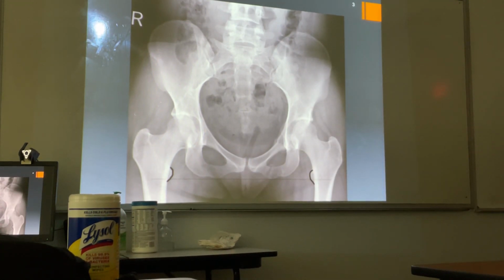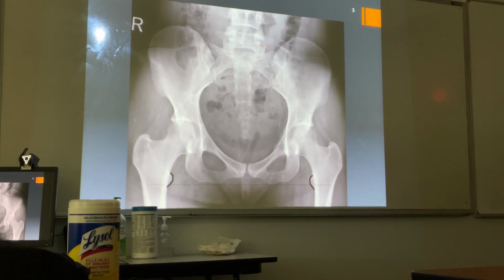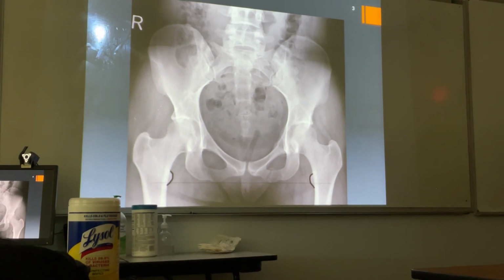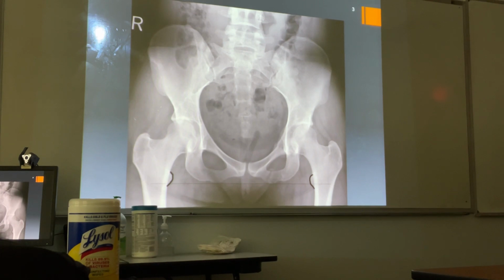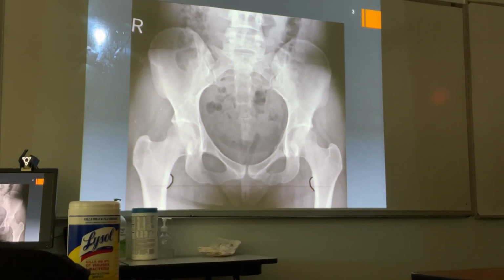My favorite example of a test case would be a pars defect that you can barely see, or degenerative changes. In other words, multiple areas of involvement. You're so focused on what you see, you forget to complete your search pattern, and now there's another area of involvement. So two disease processes or abnormalities in the same patient. All right, so it's either pelvis.